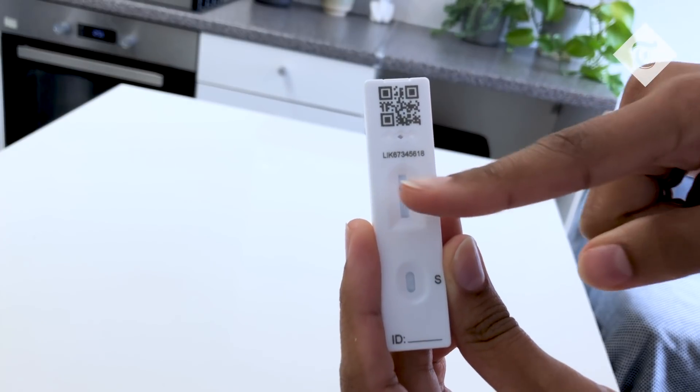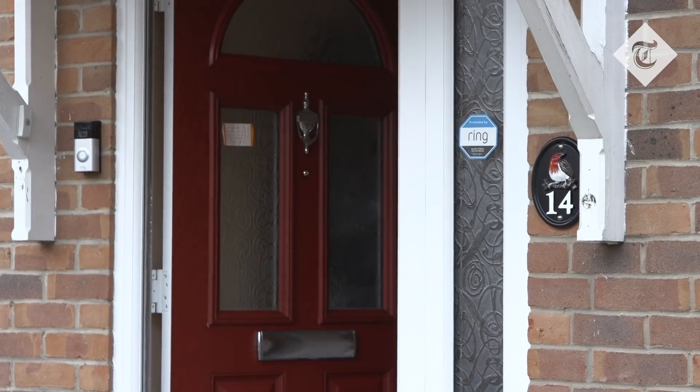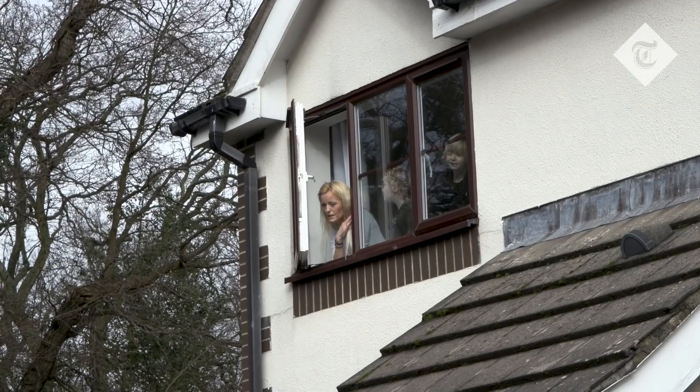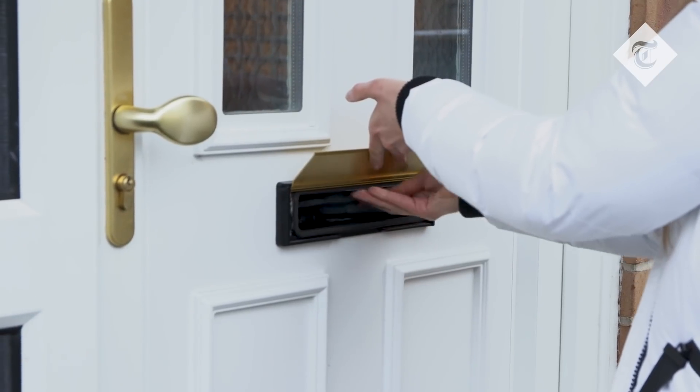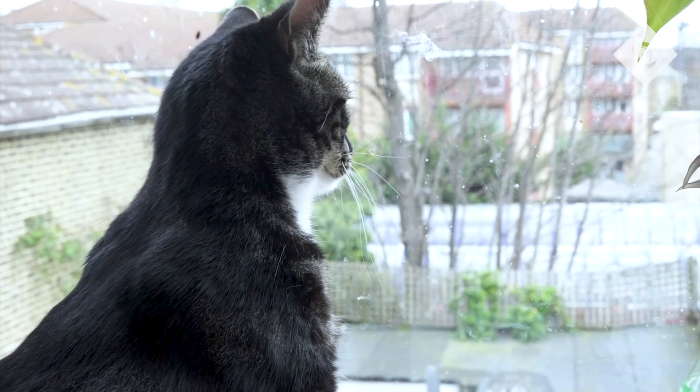Register your result using the ID number or barcode online or by phone. If you do get a positive result, you and your household must immediately self-isolate. You can book a follow-up PCR test to confirm your lateral flow result online, and if it comes back negative you can end your self-isolation.